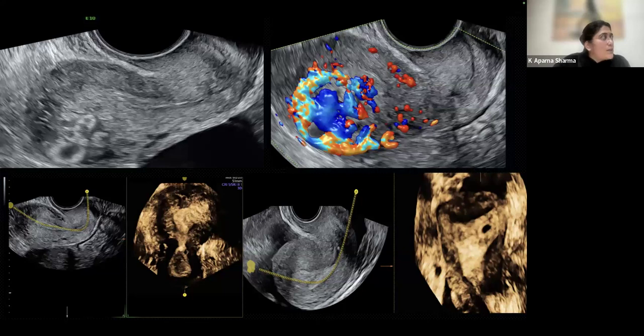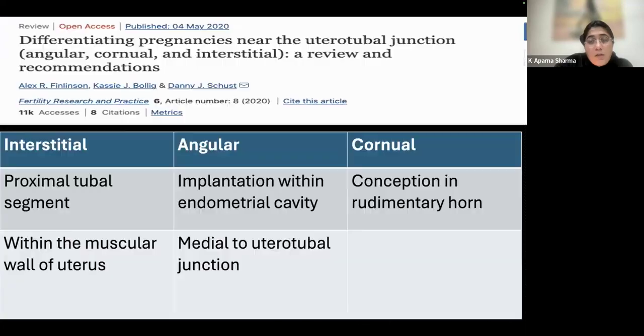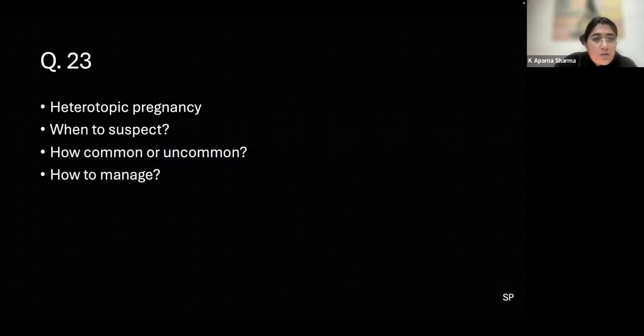Yes. Like you've very nicely said, we should avoid any other terminology. We should call it the interstitial pregnancy. And we can see that when we go through the center of the cavity, you cannot see a sac, but when you go to one side of the cavity, you can see the sac on one side. So I think these are a little tricky, and even more difficult to manage because of the bleeding and everything. So yes, it is a challenging and kind of an emergency.